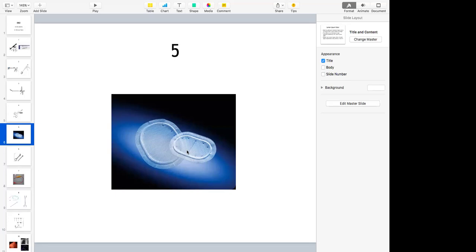Polypropylene, polyester. Okay, next is polytetrafluoroethylene, PTFE meshes. Then you could have a composite mesh like a Vipro mesh where part of it is Vicryl and part of it is Prolene. The Vicryl part gets absorbed and the mesh becomes lightweight later on.